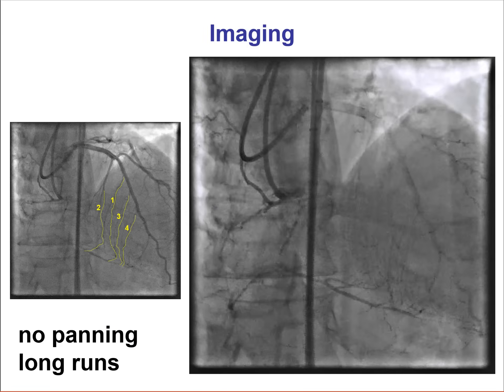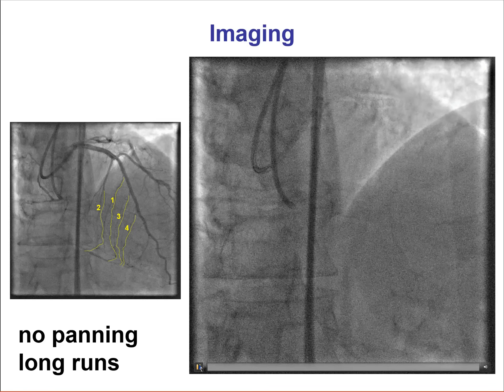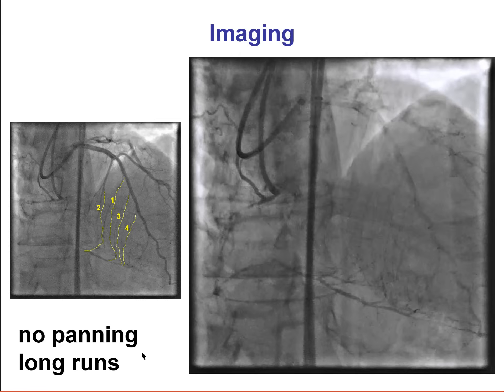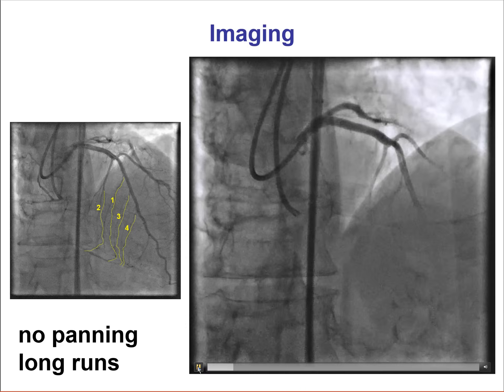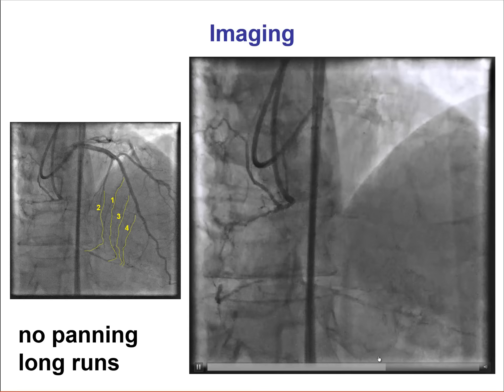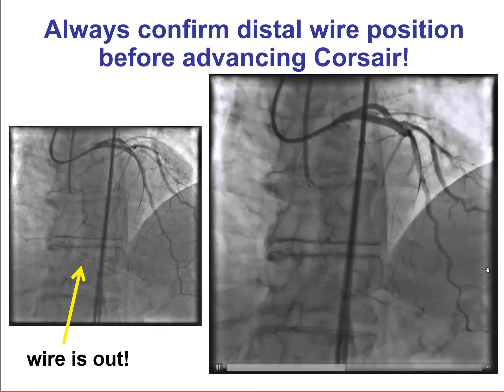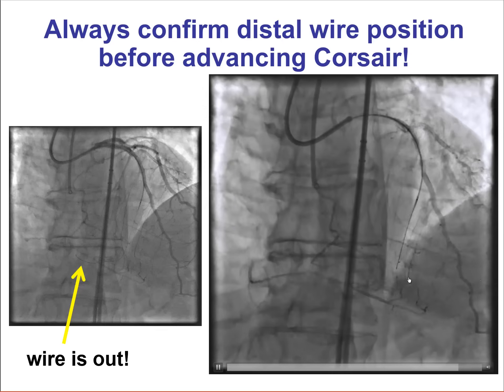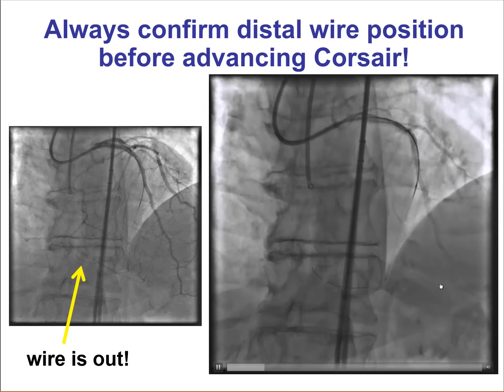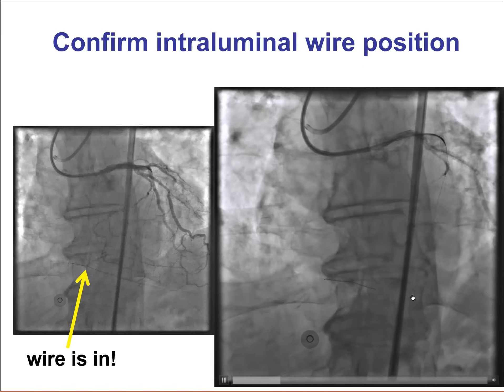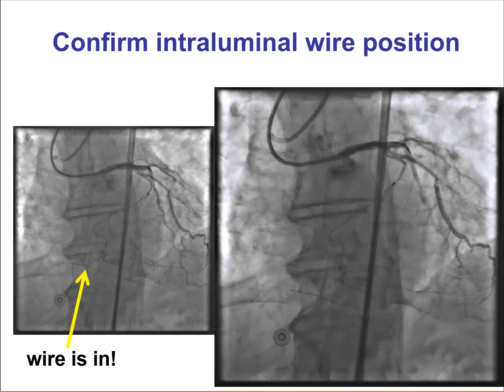This is an example of a dual injection for evaluating the collaterals in a patient with a right coronary artery CTO. This requires detailed evaluation and then grading of the collaterals in terms of ease of use. We try to appreciate which would be the best collateral to attempt first and what are the subsequent choices. This is the same patient during attempts to cross — the wire here is outside the vessel, which is important to know before advancing the Corsair. Once the wire is repositioned, it is now in the distal true lumen, and we can proceed with crossing the collateral with the Corsair.